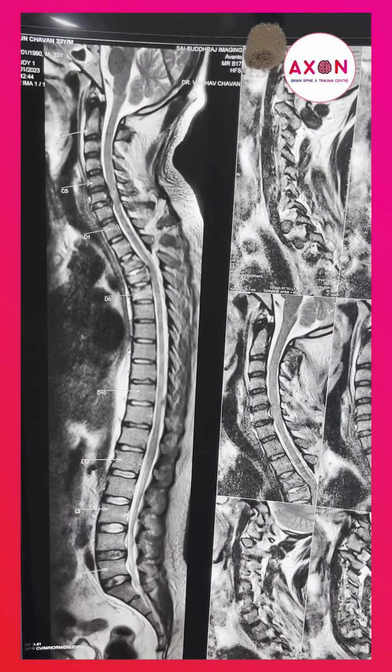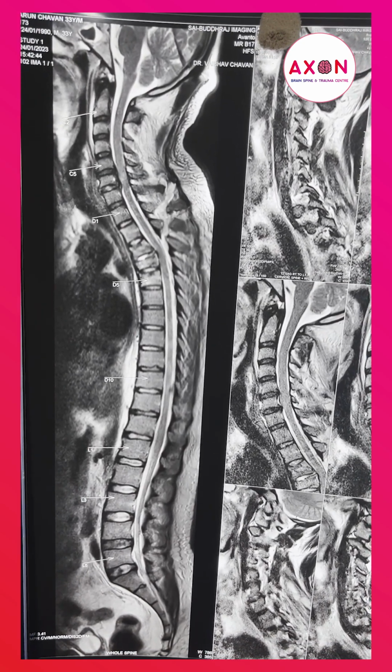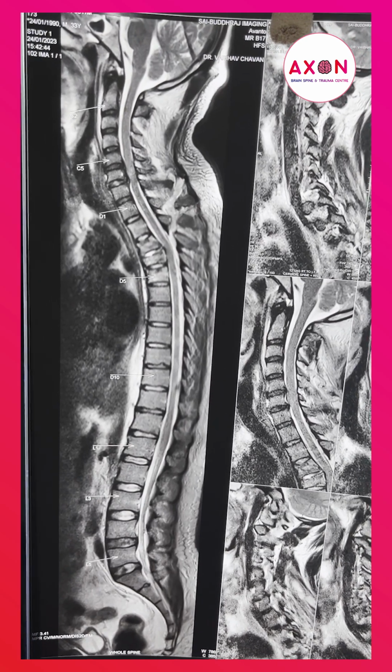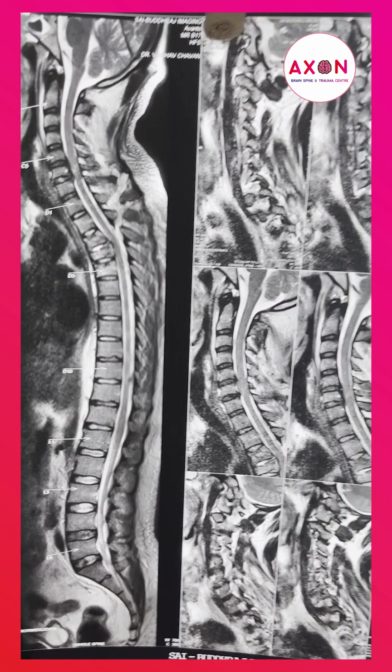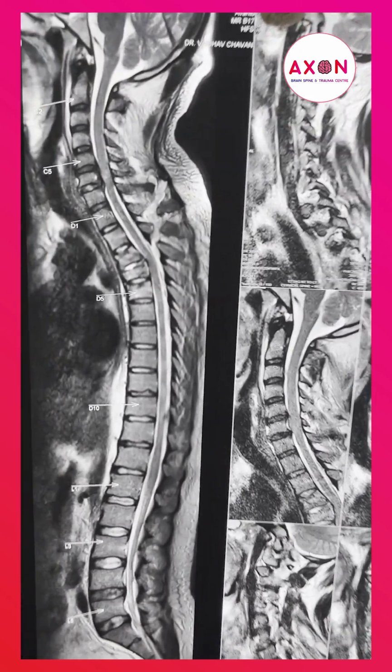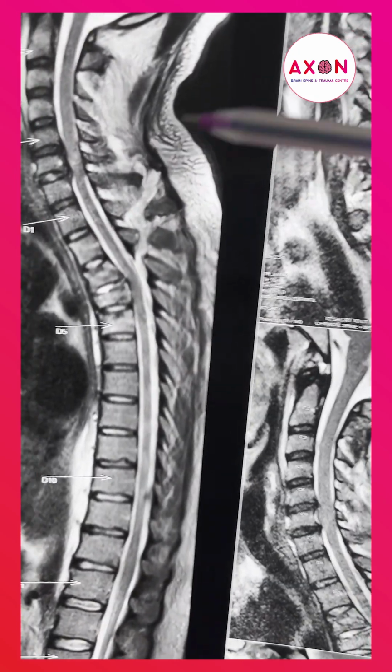Hello, this is Dr. Vaibhav Chavan. Today I am going to present a case of post-traumatic quadriplegia paralysis due to cervical canal stenosis as well as post-traumatic thoracic vertebral compression fracture. This is a pre-operative MRI. We are going to discuss the radiology.